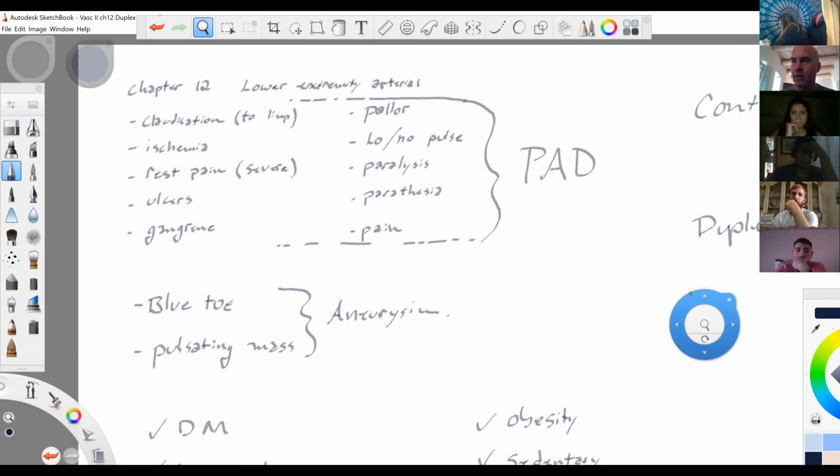It's either upper arm arteries or veins. Kind of doesn't matter. Well, it matters for your reading, of course, but same difference. DVT studies, mapping studies, arterial studies, and a lot of it is just repeated. It's just different anatomy.